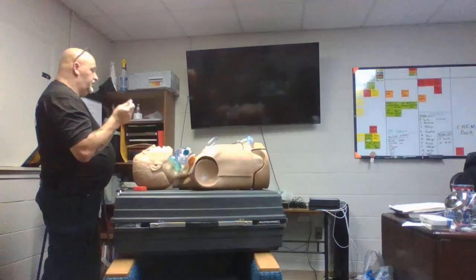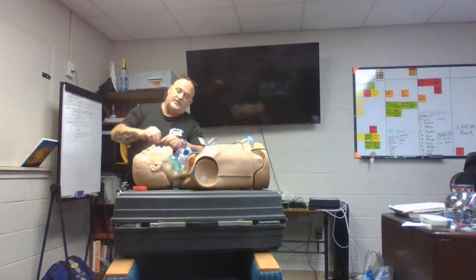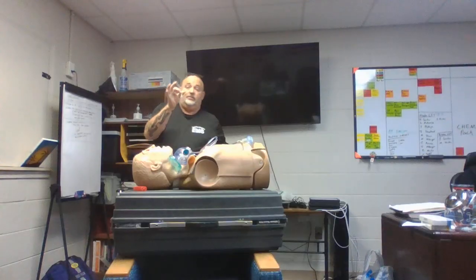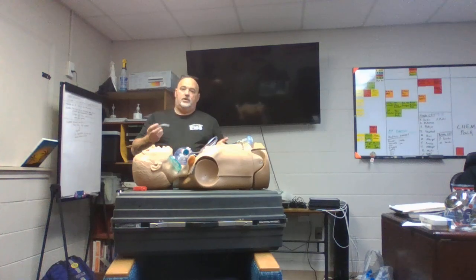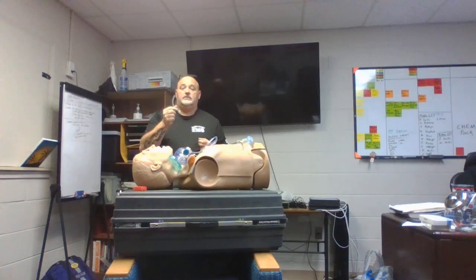But I have put lube on it. I have put gel on it. And this mannequin's nose does not want it. He cannot take it. So basically, I will not be able to show you how to place this. I apologize. This is an airway mannequin, so you would think you'd be able to do that. Crazy, right? So, first thing we're going to do, we're going to select the correct size.